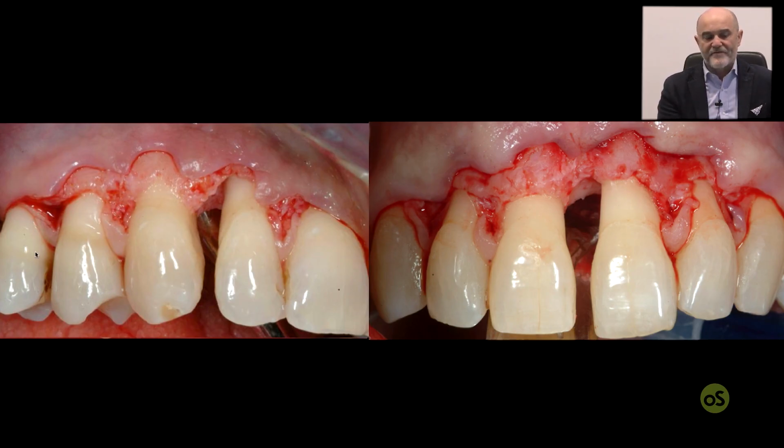So we open a flap from 1 to 6, 1 to 7, and all incisions at the level of the space neighboring the defect are directed towards a midline passing through the canine. The remaining papillae are desepithelialized. The flap is freed from muscles and coronally advanced.